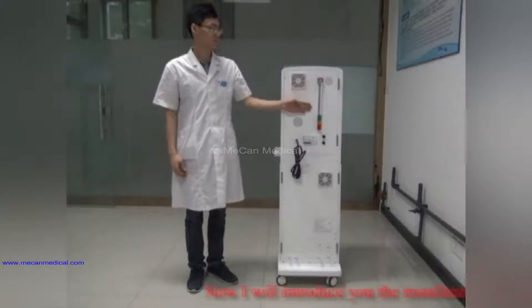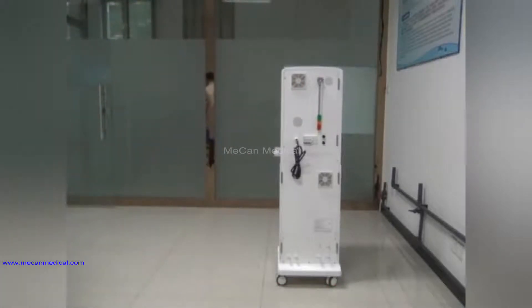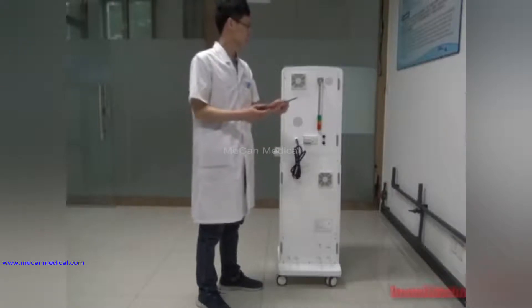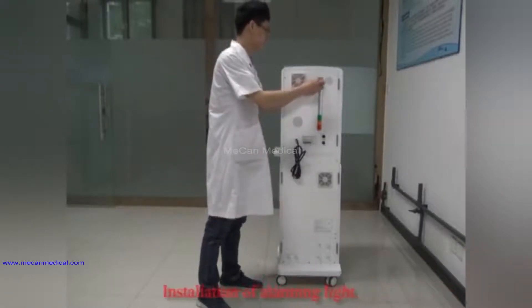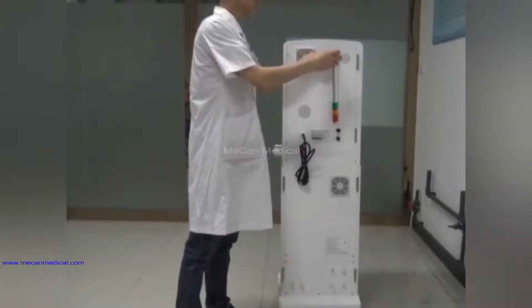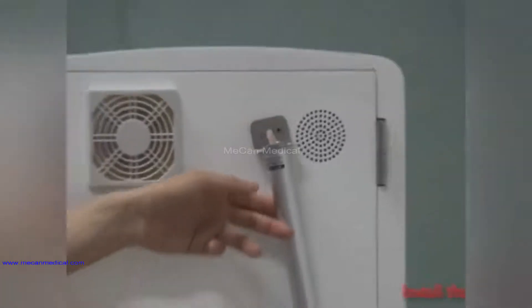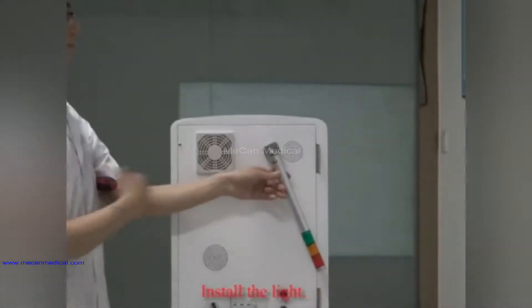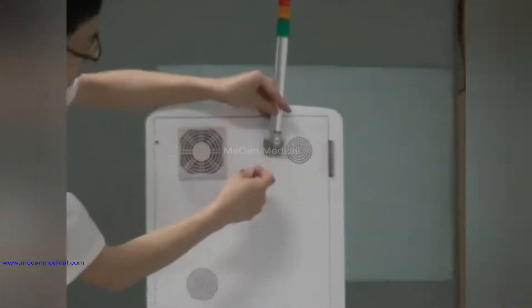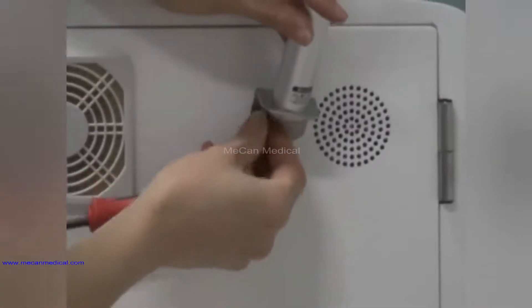Now I will introduce you the installation of the alarming light. Use the cross screwdriver to remove the screw. Install the light and fix the screw. Installation is finished.